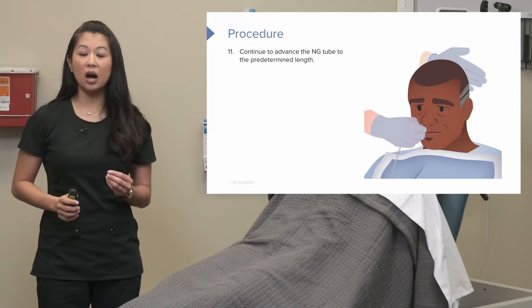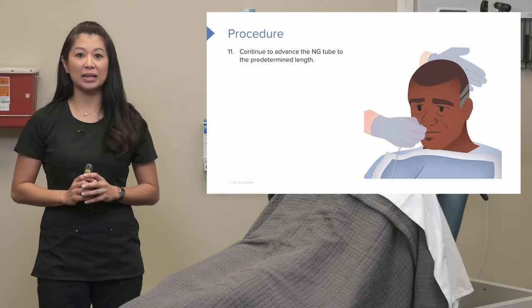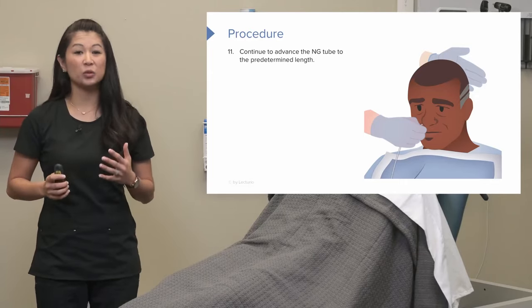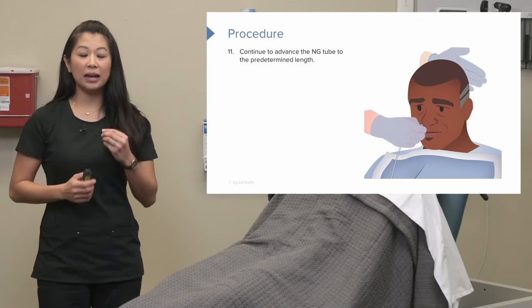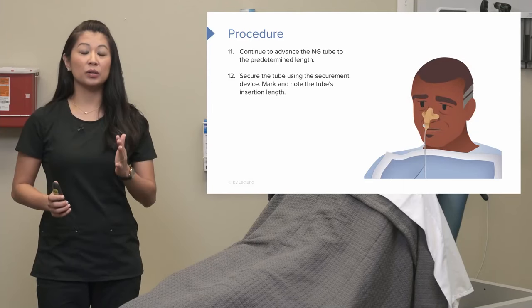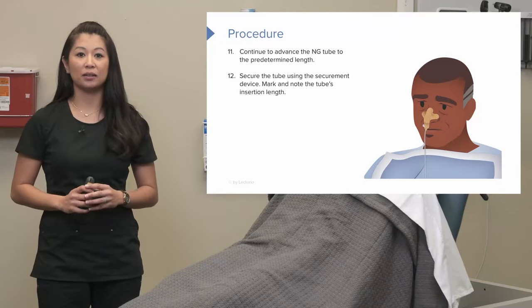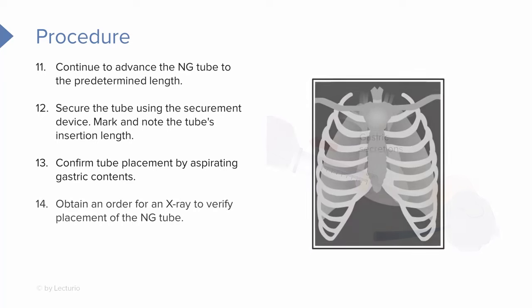If it goes smoothly with no coughing or gagging, we can continue to advance the nasogastric tube to the predetermined length. When advancing, if you go really slow it just drags on the procedure — so if that tube is going down, go quickly and keep advancing. Once that's done, secure the tube using a securement device to the correct insertion length. Then confirm tube placement by aspirating gastric contents with the piston syringe. Next, obtain an order for an x-ray to verify the exact placement and positioning of the nasogastric tube.